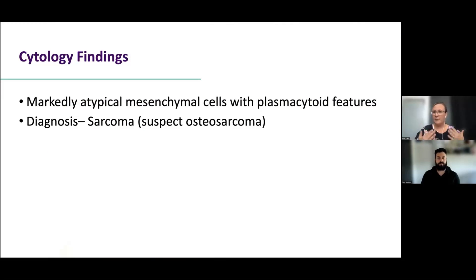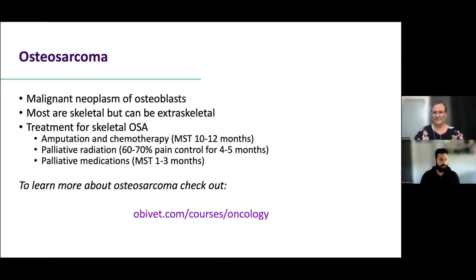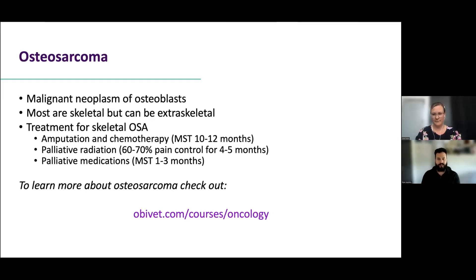We have a markedly atypical mesenchymal population with subtle plasmacytoid features. We can make a confident diagnosis of sarcoma on cytology and strongly suspect osteosarcoma. The reason I don't say 100% is because there are overlapping cytologic features between different sarcoma types, so histopathology or special stains are needed to confirm. That pink osteoid matrix is a really neat feature — I'd always seen it mentioned on cytology reports but now you can see what it actually looks like.